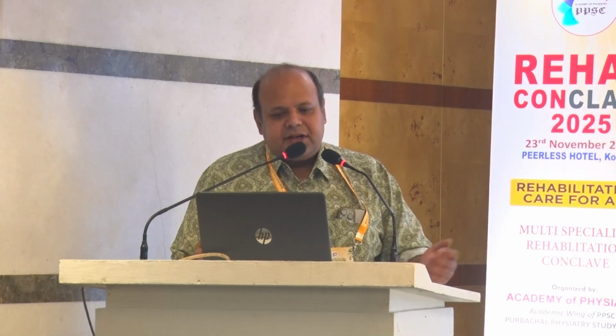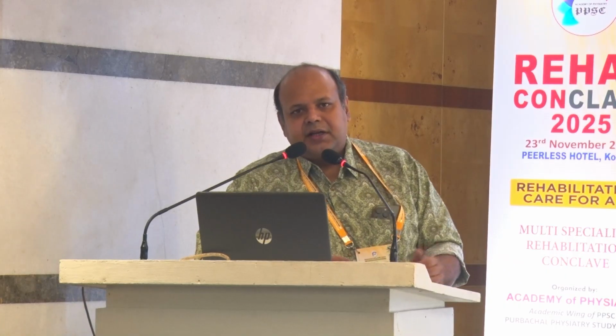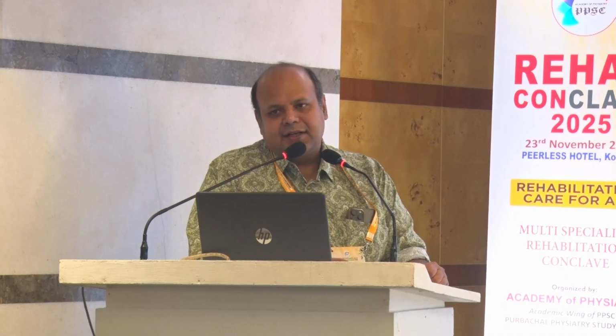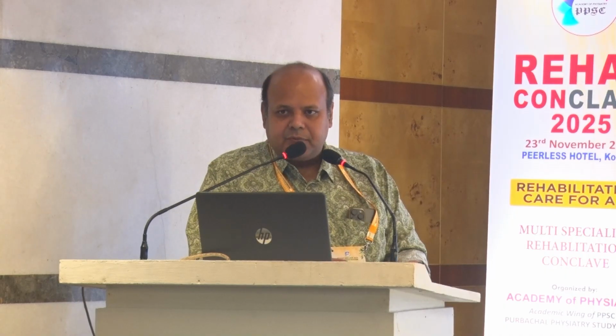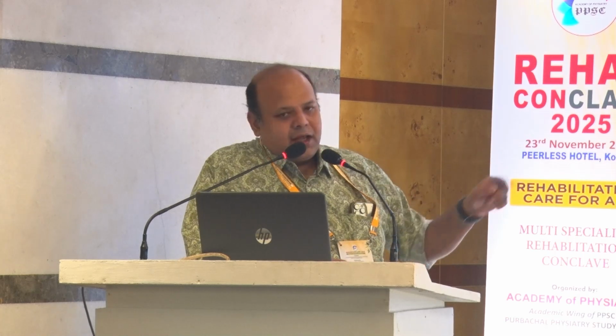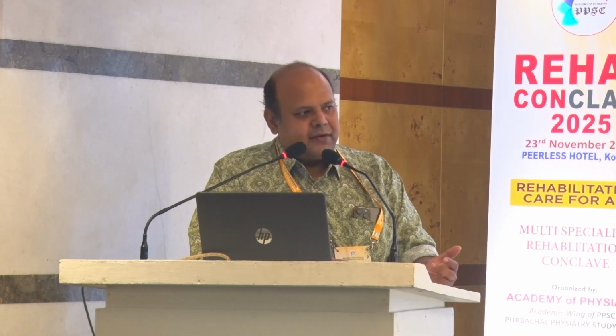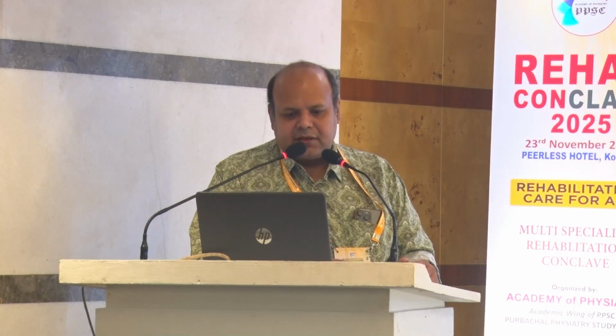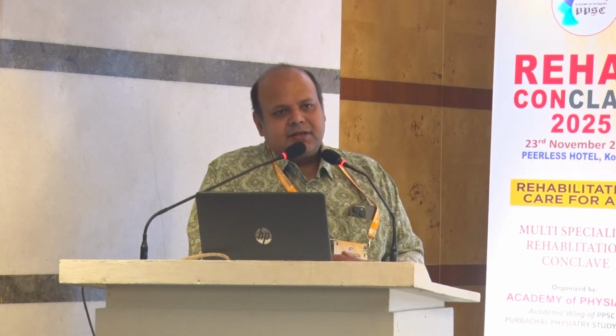Now, these are the 3 transducers we have in our department in a machine. You see this is one C51, that is 1 megahertz to 5 megahertz probe. That is for the deeper penetration. This 312, usually it was 512 in our textbook. That is just, they have made a bit differently. So it's a 312 probe.